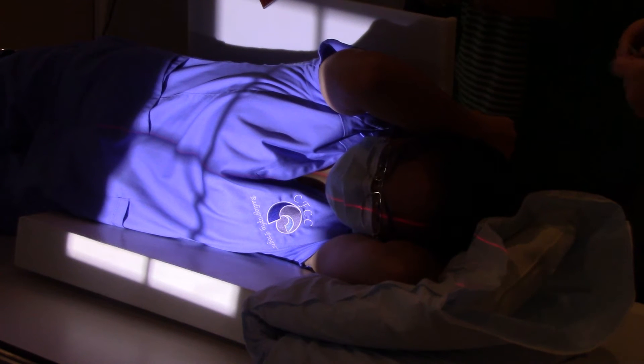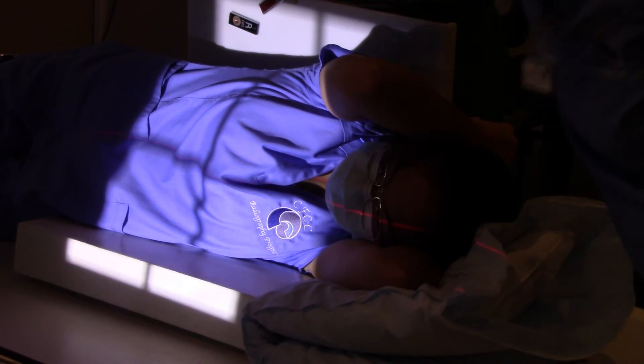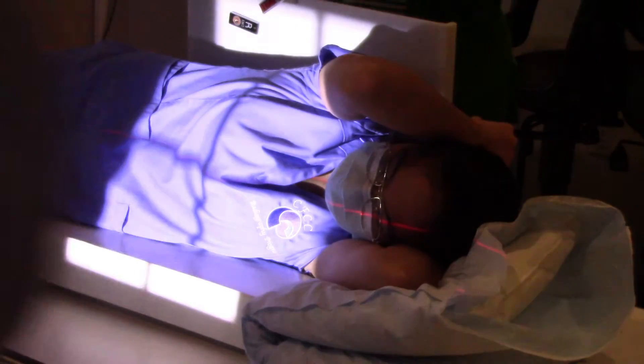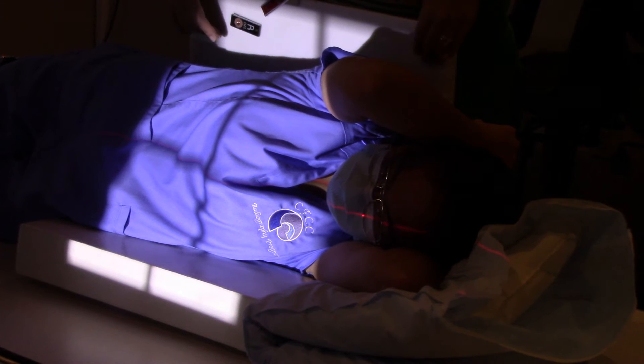You see all that light down there? You could put your marker anywhere in there — that works. Most patients that are hypersthenic and have a lot of tissue, you would probably definitely look here. But you have plenty of viewable light here.